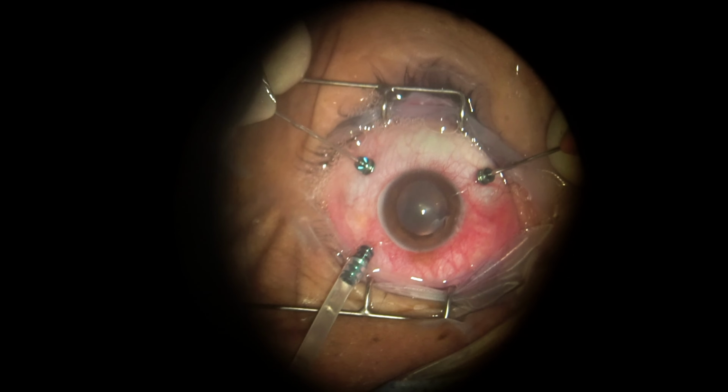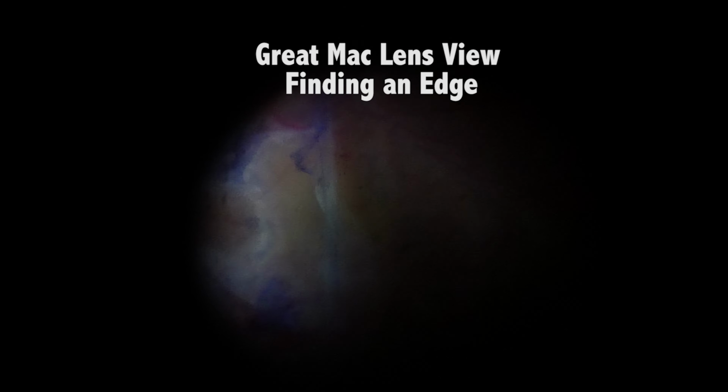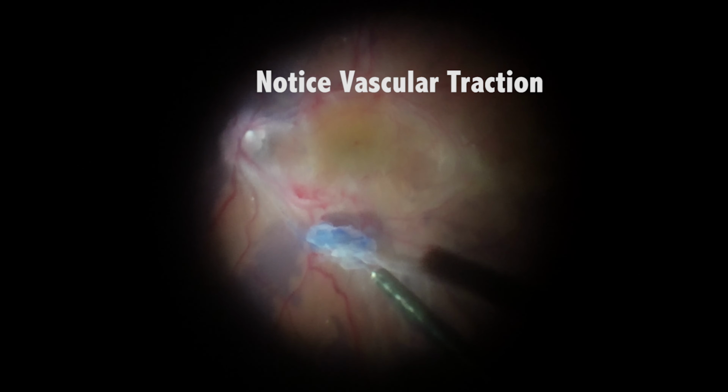The adherent and taut epiretinal tissue is then removed after an edge is grabbed and lifted carefully from temporal to nasal. The pucker is peeled off in an en bloc manner, freeing up the macula thoroughly. You may notice vascular traction and tortuosity at vessel sites.